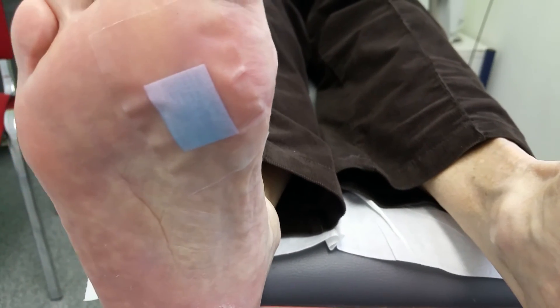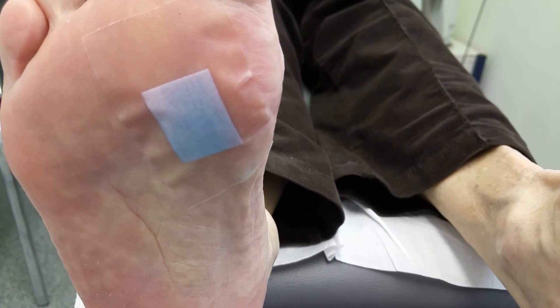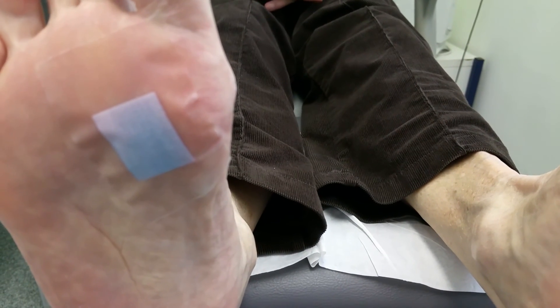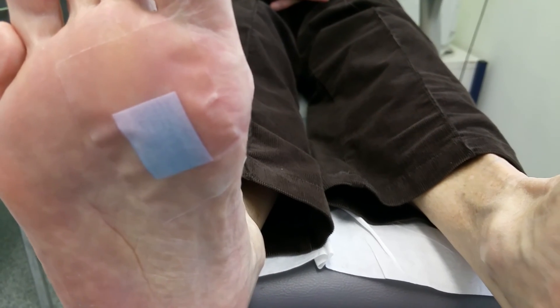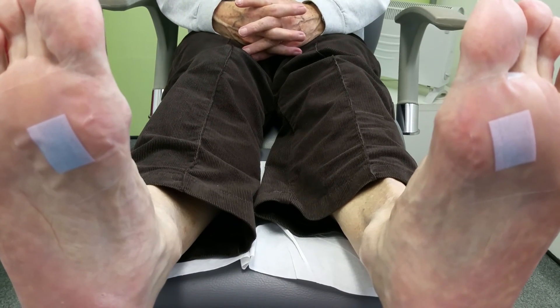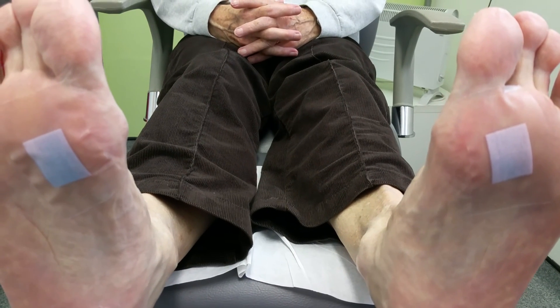This is just confirming it and showing you how to use these patches and the benefit of them as being a very early way of screening for diabetic peripheral neuropathy. Do see our website at undefeated.org for other information on tests that you can have done and what the results can mean for you.